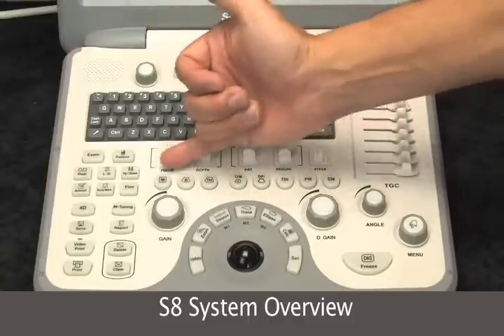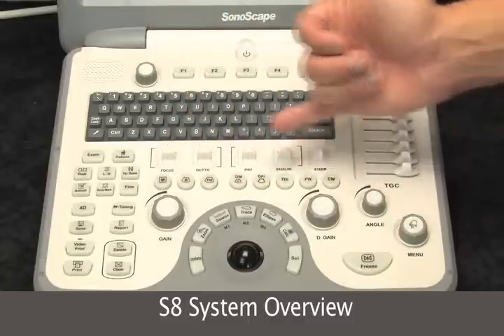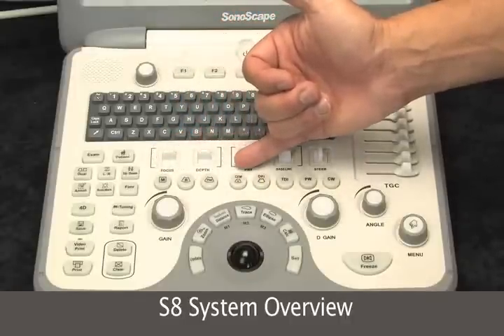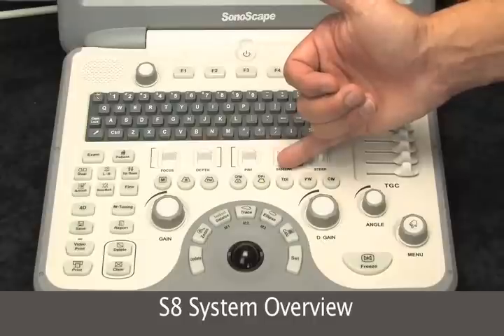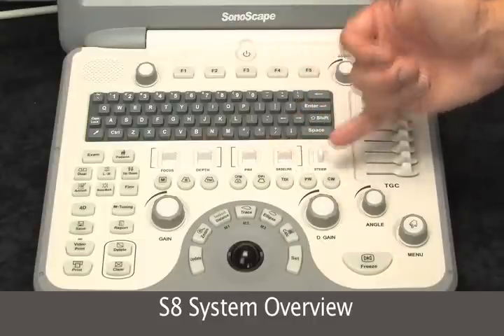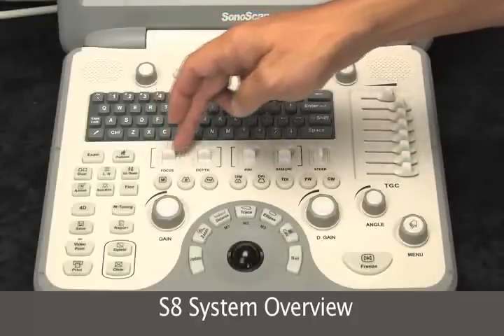Right above the main mode buttons we have M-mode, B-mode, tissue harmonics, color flow mapping, Doppler power imaging, tissue Doppler imaging, pulse wave, and continuous wave, along with the control buttons for those.